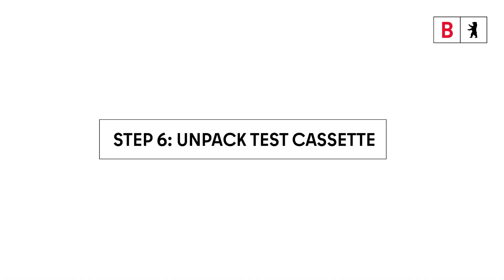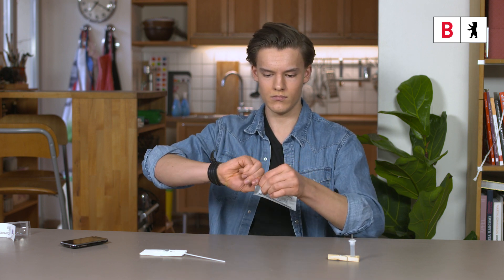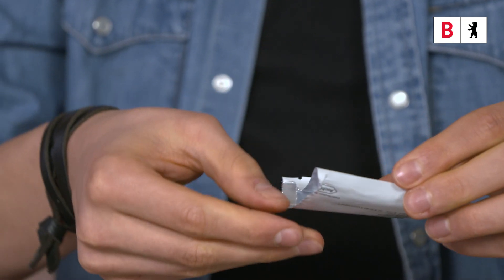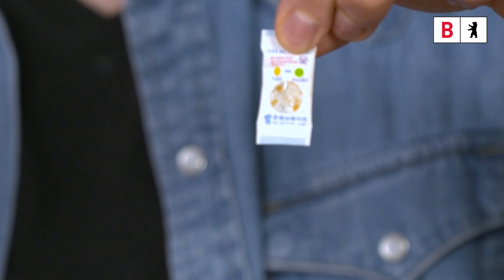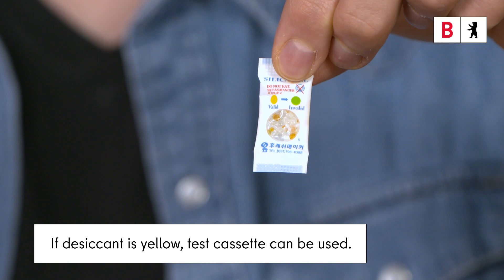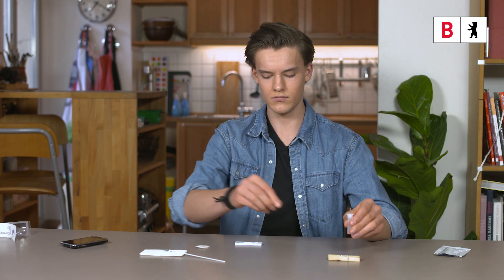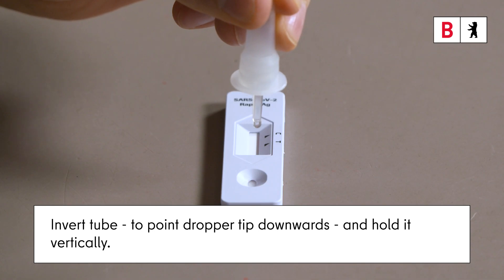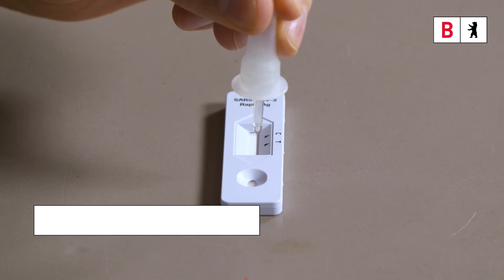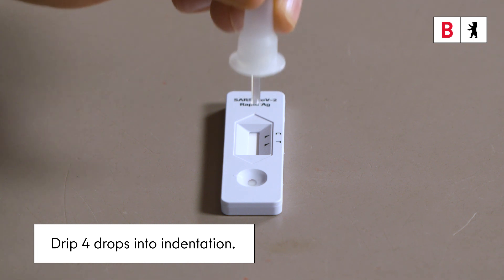Step 6. Open the test cassette and place it on a clean surface. If the desiccant in the small bag is yellow, the test cassette can be used. The small bag will be disposed of later. Invert the tube and hold it with the dropper tip vertically downwards. Then drip 4 drops into the indentation while gently squeezing the tube.